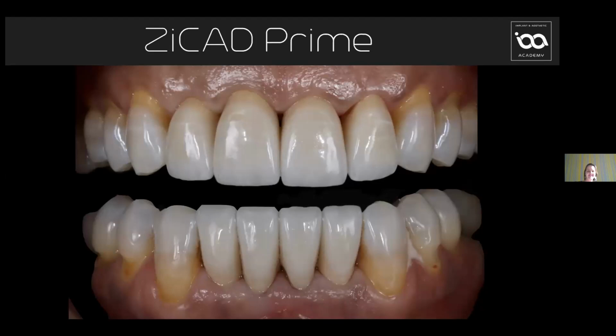So in this case, we had to micro-layer these, just the top ones, not the bottom ones. The bottom ones were stained, and just a staining and glazing procedure. But I think if someone said to me that you'd get an outcome with zirconia restorations like this 5 years ago, I would have said no way.